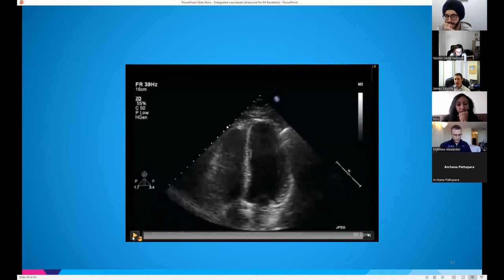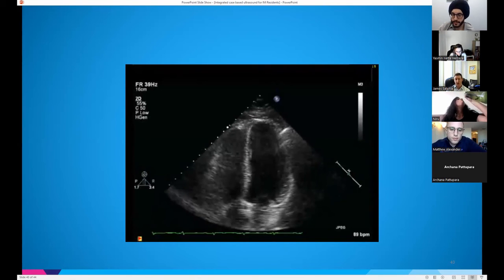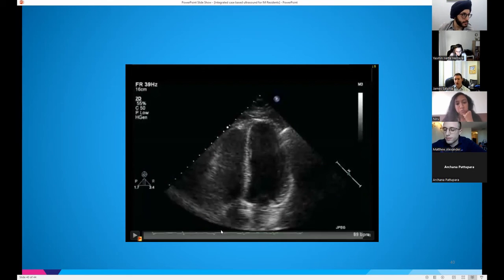The RV is a thin-walled ventricular structure. It hates afterload. It cannot handle afterload. The LV can handle tons of afterload. The RV can't handle any afterload. All of a sudden, you increase the pressure from anything, but usually with acute change, it's a PE until proven otherwise, but not always. It's a sign of pressure overload.